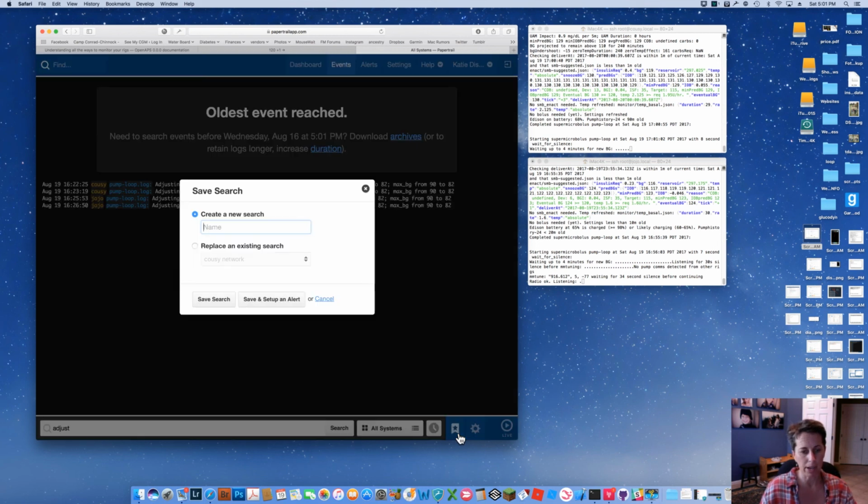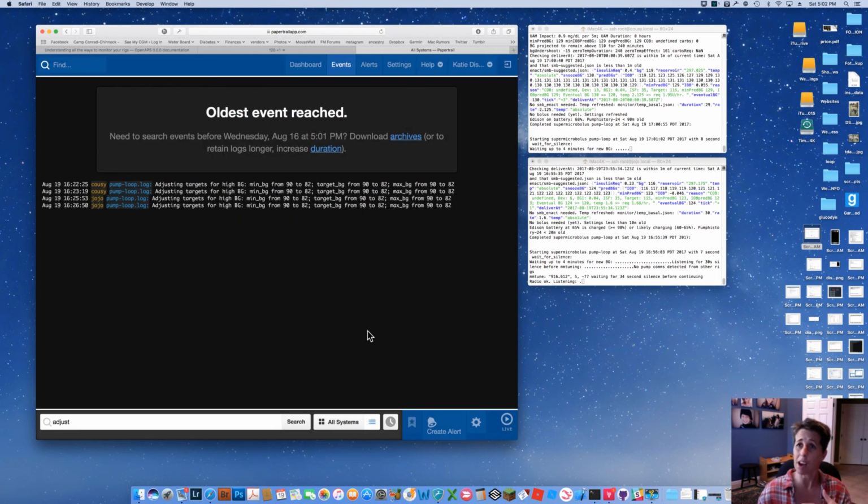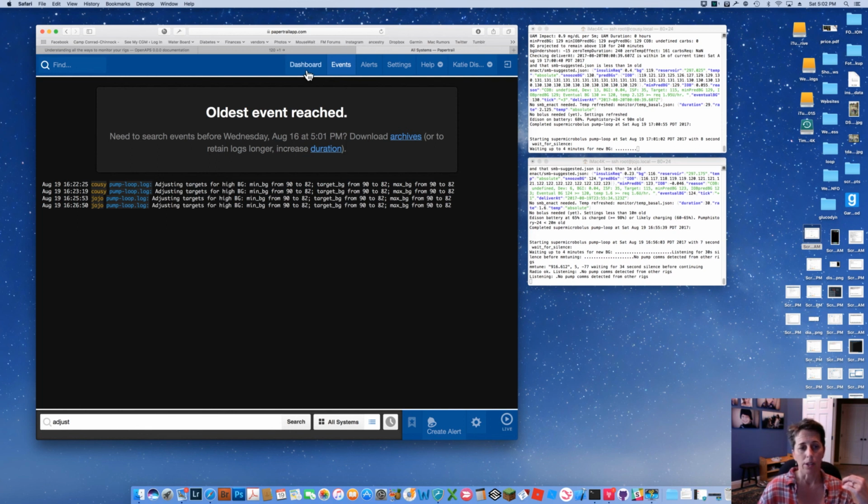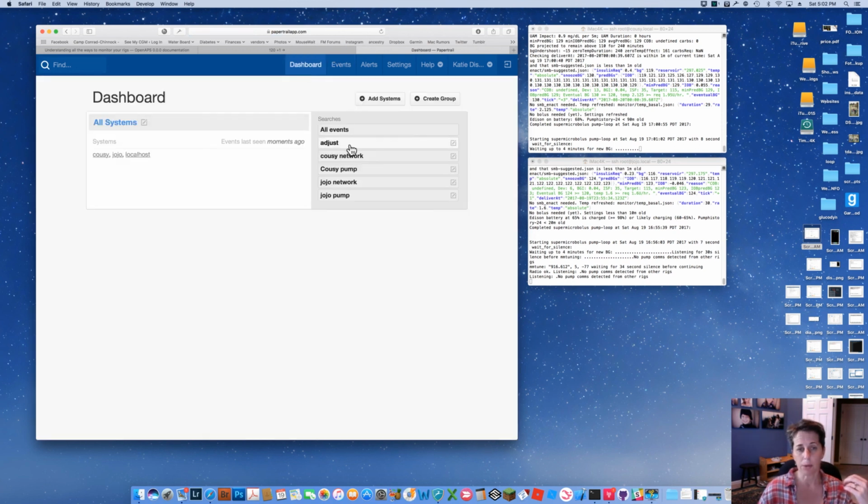This is one I definitely also recommend saving, because it will tell you which direction AutoSense is sending you in, which is really good. So if you're finding yourself going high or low unexpectedly, and you're saying, wow, I thought I adjusted my settings, go and look at what AutoSense is doing in addition to what you did. And if it's going in the wrong direction, maybe you want to consider doing something else. Or if you want it to be more aggressive or less aggressive, you might adjust your preferences, the multipliers. So anyway, that's another good saved one.